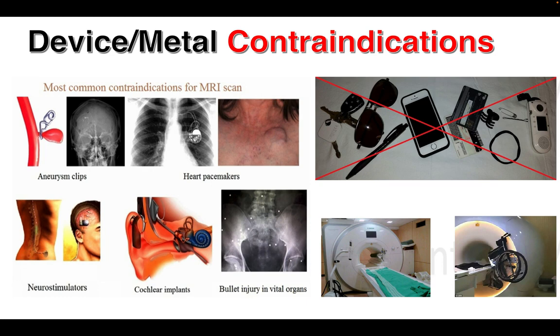Not everyone is a candidate for an MRI exam due to unsafe devices like pacemakers, aneurysm clips, neurostimulators, and certain types of shunts. As MR technologists, we have to follow strict guidelines for MR safety, and of course, we will discuss that in much greater detail in the MR patient care and MR safety modules.